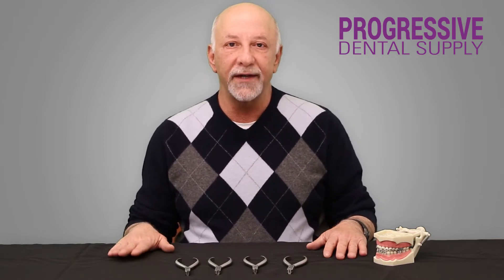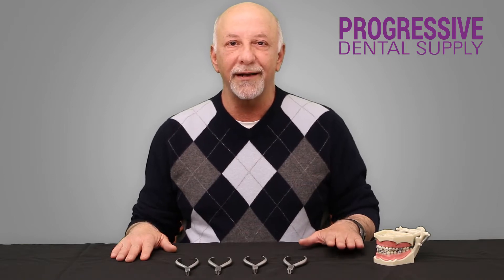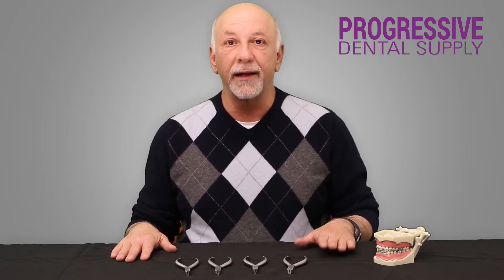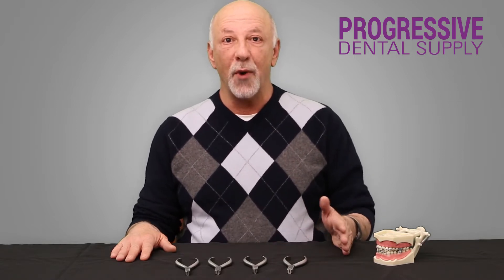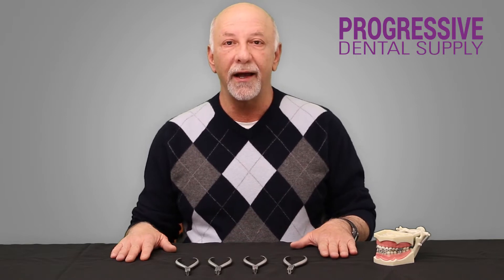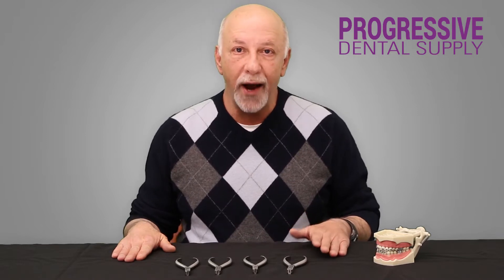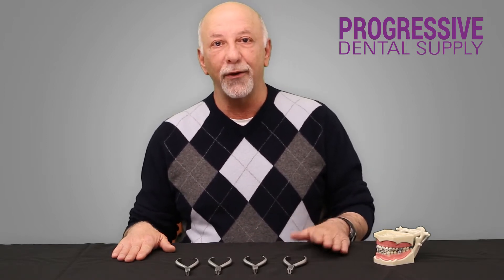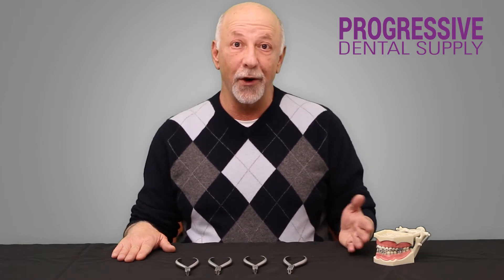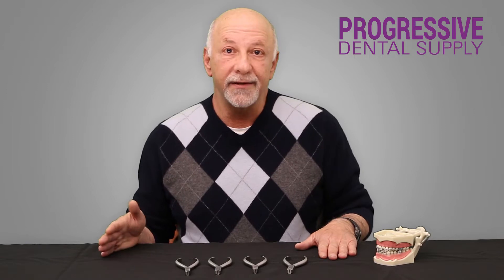This is a set of second order bend pliers. Second order bends are typically those bends that we try to avoid, and the most common way to avoid these bends is by repositioning brackets. But what happens after you reposition the bracket and you still have a root angulation problem? Trying to reposition the bracket at that point might actually create a root angulation problem towards the other side, so at that point we're forced to make a second order bend.